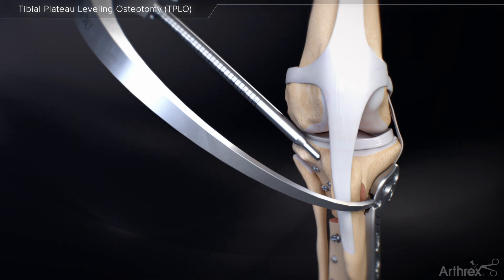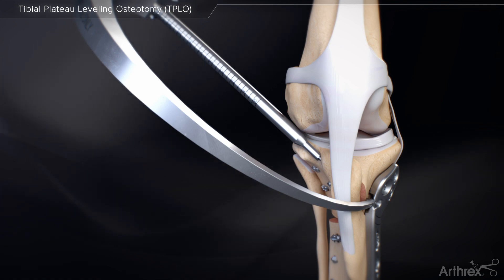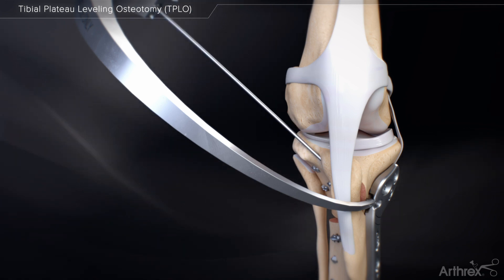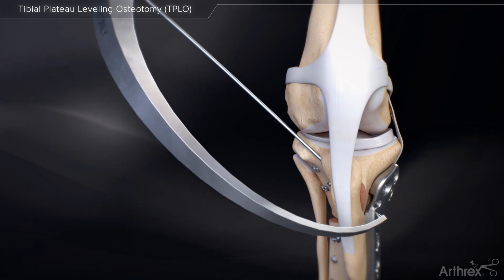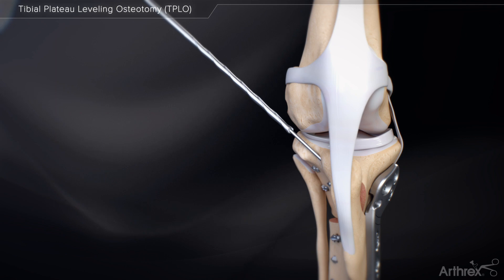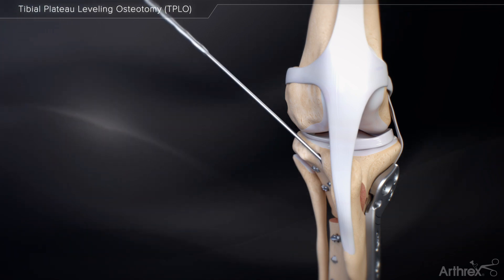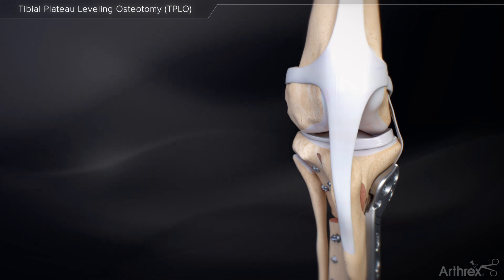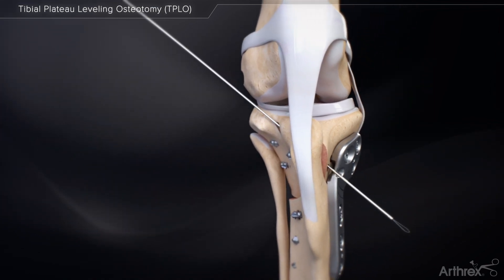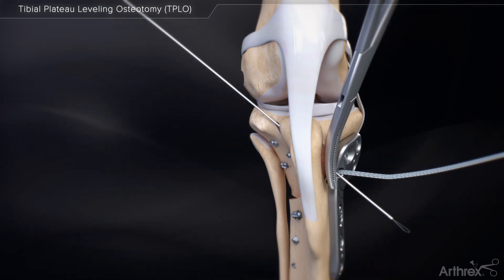Drill the appropriately sized K-wire for the tibial tunnel, lateral to medial, making sure the K-wire exits near the open hole in the TPLO plate. Remove the drill guide after properly placing the K-wire. After placing the appropriately sized K-wire, use the appropriately sized cannulated drill bit to create the tunnel. Loop the suture material through the suture hole on the TPLO plate and shuttle both ends through the tibial tunnel using the nitinol suture passer.